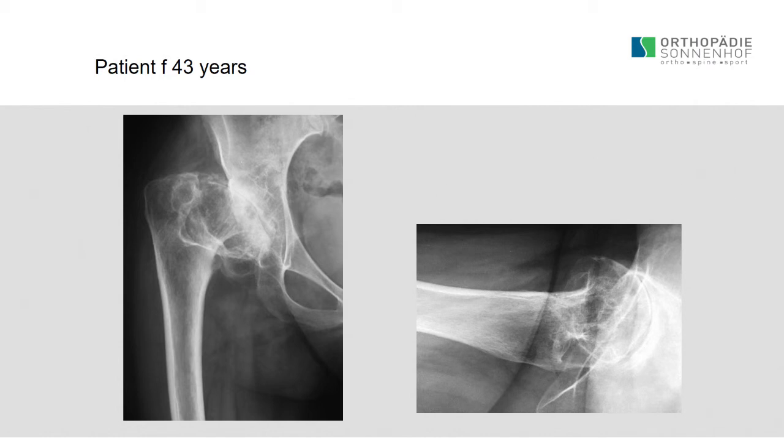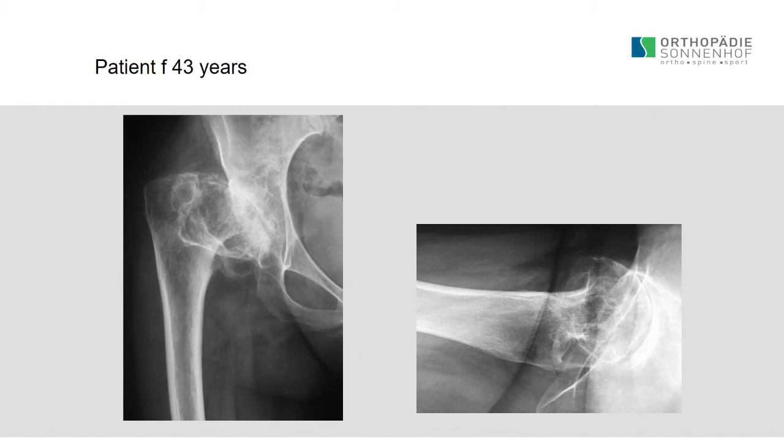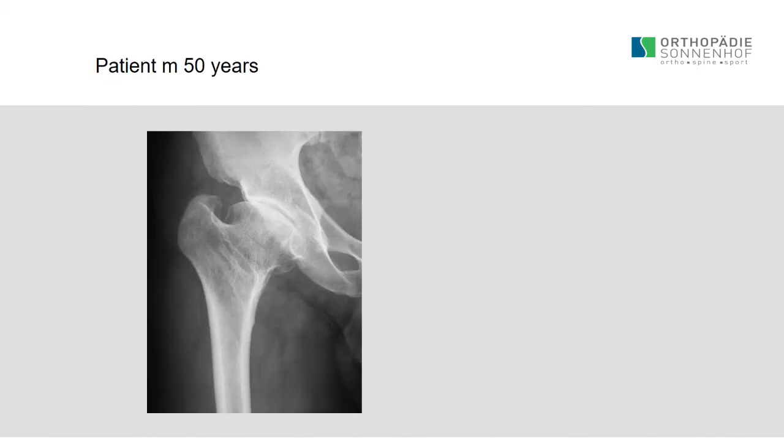augmentation of the acetabular part, but here we had to bring down the trochanter because in the former operation it was almost 90 degrees to the normal direction of the insertion of the gluteus medius. Also, a case that is now 5 years down the road.